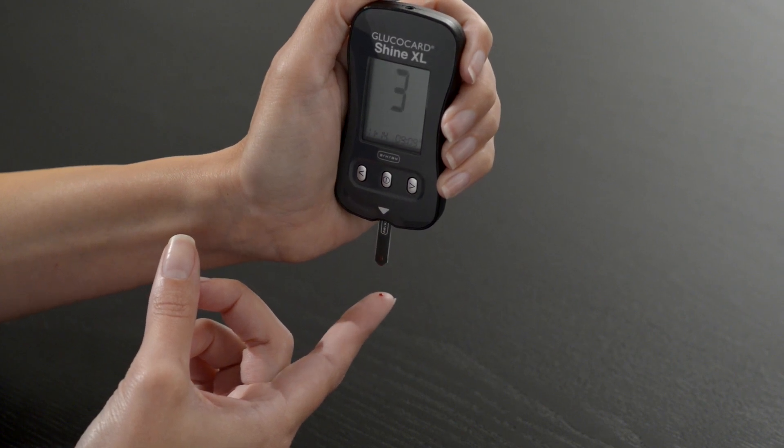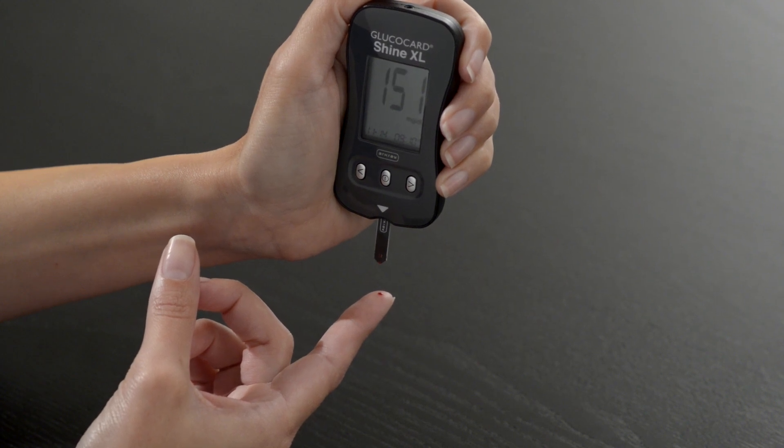Once the meter has finished counting down, your blood glucose result will appear and your test is complete.